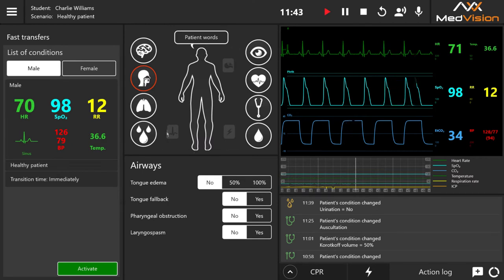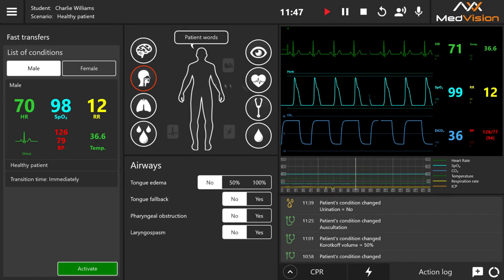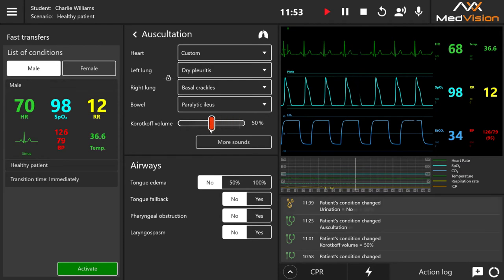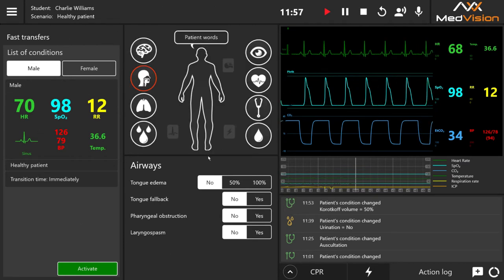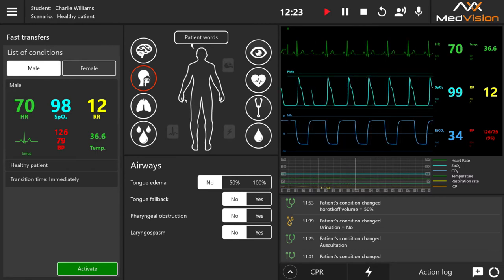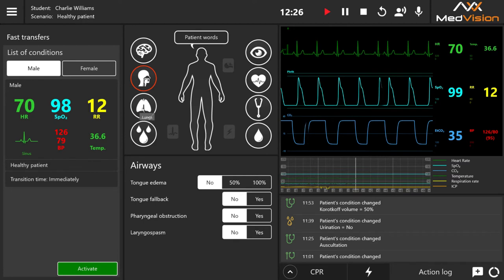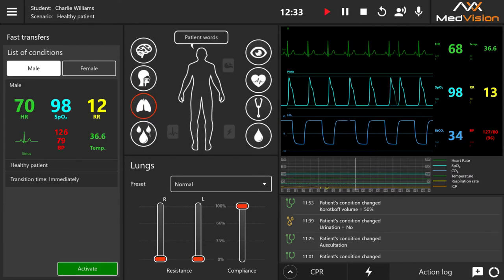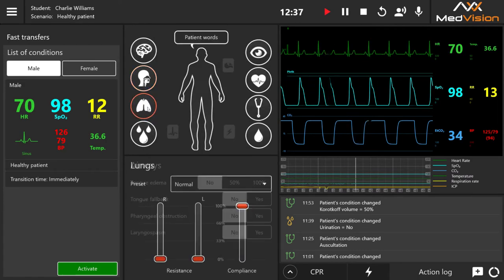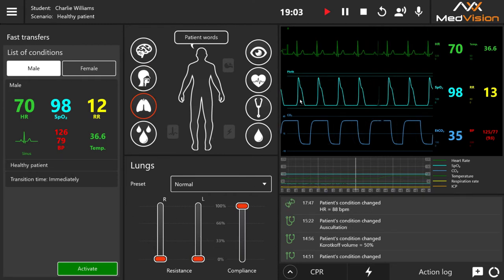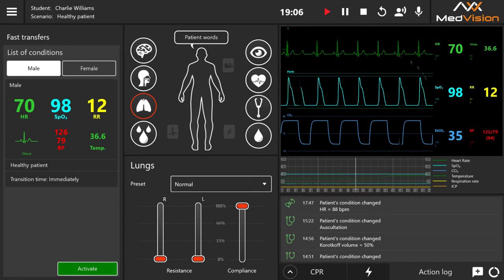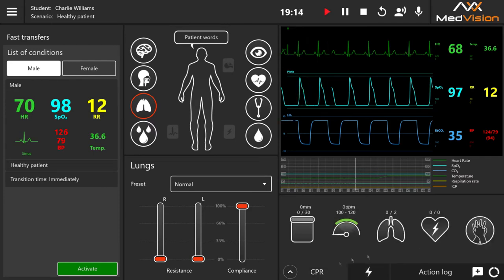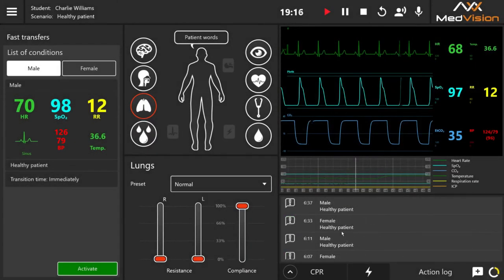All settings are optimized for both touch and mouse input. With touch, the big sliders make it very easy. The interface is responsive and fluent. With touch input, you can long-press an icon to pin it so you can have two menus open simultaneously; with a mouse, press the mouse wheel button to do the same. On the right section we have patient monitor controls, forecasting screen, and tabs at the bottom for action log, AED controls, CPR, commenting, and a filter to show only patient condition changes.